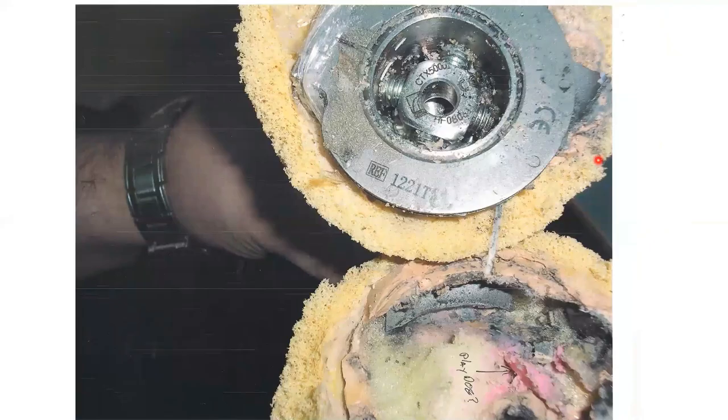What had occurred, as soon as I saw this picture, he didn't have to tell me what happened. I already could tell because if you look down here, we have urethane foam. There's no lamination. If you try to bond this component onto foam, this is your weakest link right here, the foam. The foam is going to start to crush.